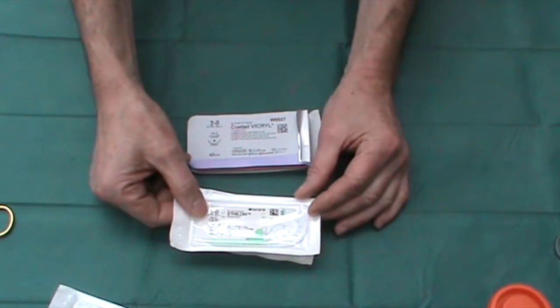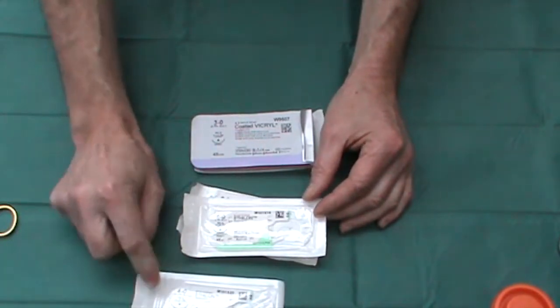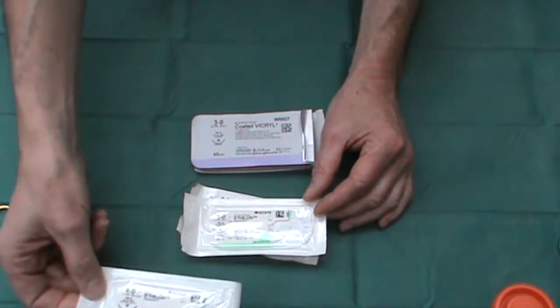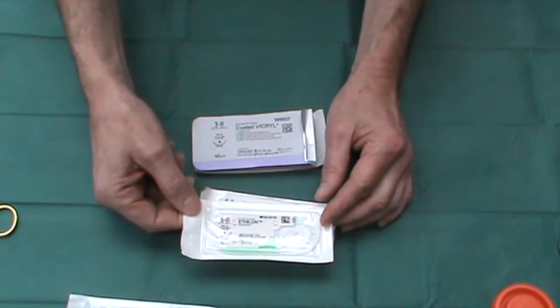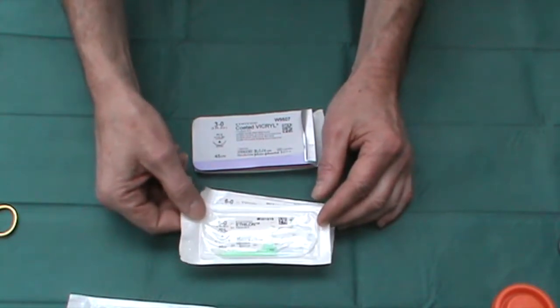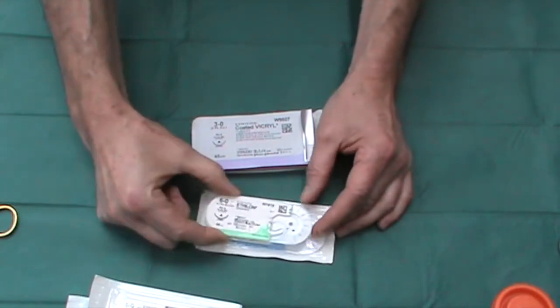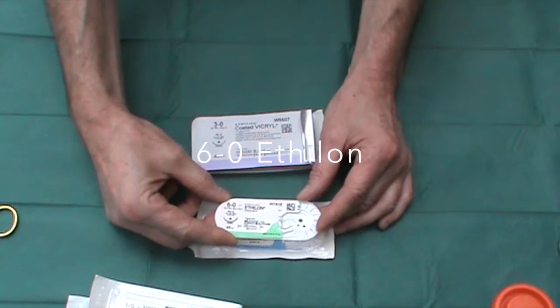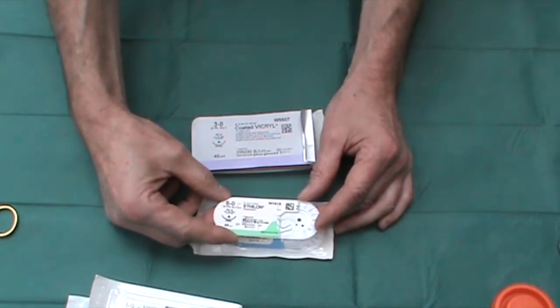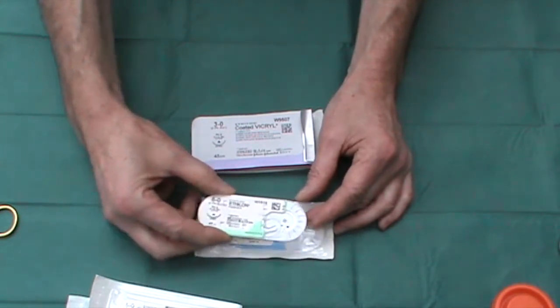This suture is on a 16mm cutting needle. A 19mm needle is fine for large lesions, but for smaller lesions a 16mm is a perfect size needle. If, however, I'm operating on the face, I'll use a much finer 6-0 Ethylon, again on a 16mm needle — any smaller than that and it becomes difficult to handle the needle.